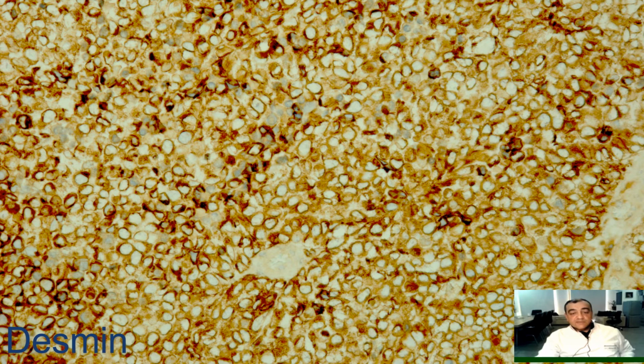Those stainings must be disregarded, and really strong cytoplasmic staining with desmin must be estimated as positive for myogenic differentiation.